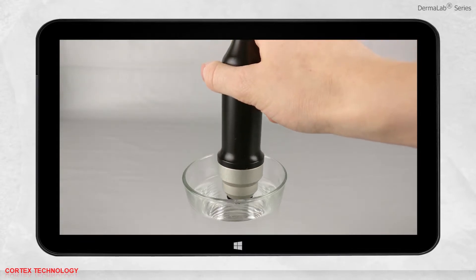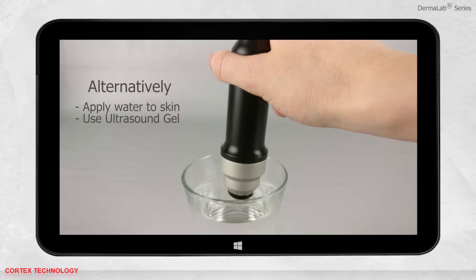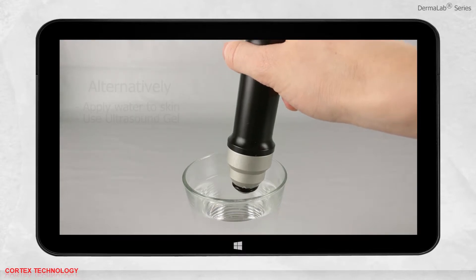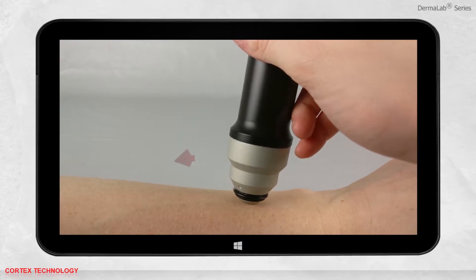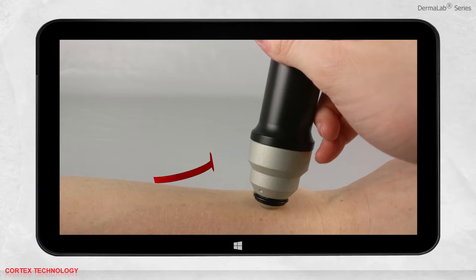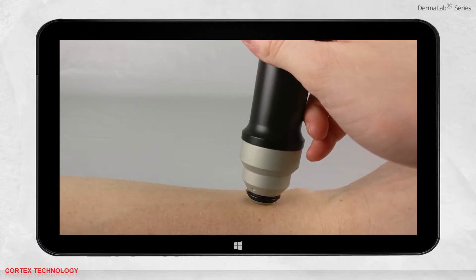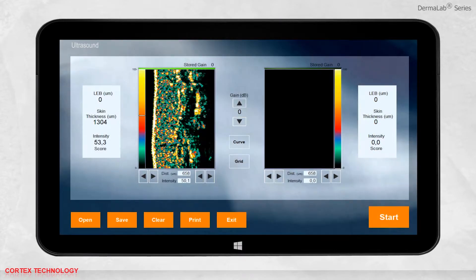Apply a drop of water to the probe; alternatively you may place a drop of water on the skin or apply ultrasound gel. Place the ultrasound probe where the measurement should be performed and do a massaging movement with the probe to spread the water evenly to the thinnest possible layer. Now press start. When pressing the start button, an ultrasound image is recorded in the active window, which is indicated by the green bar.